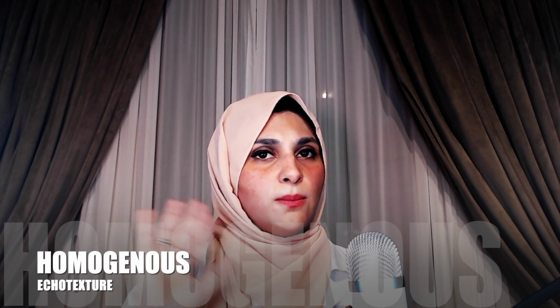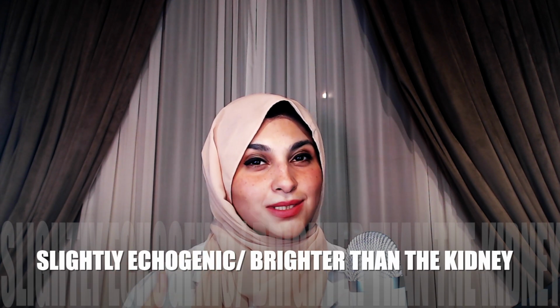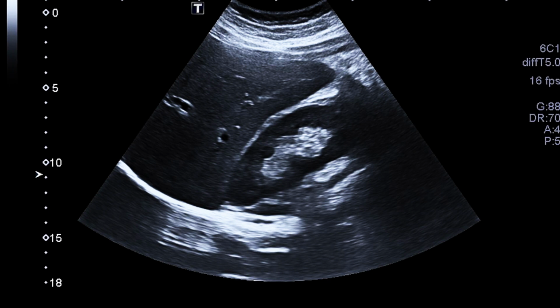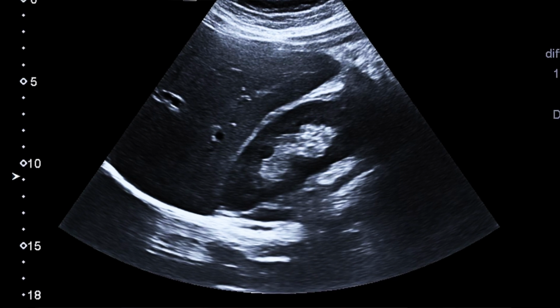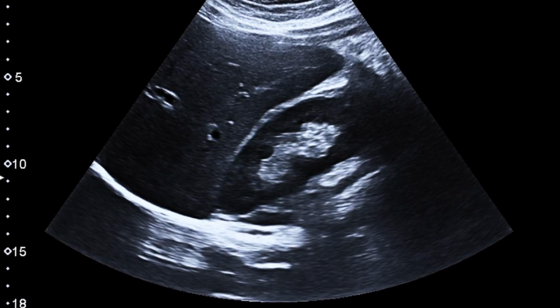Number two, it has a very homogeneous echo texture. Number three, it is echogenic or slightly brighter than the kidney. These are the main three things from which we usually identify a healthy liver. So these four points are very important: the size, the outline, the echo texture, that is homogeneity, and the brightness of the liver.